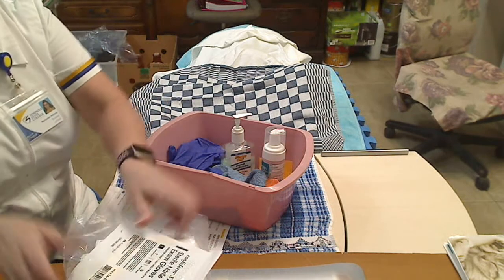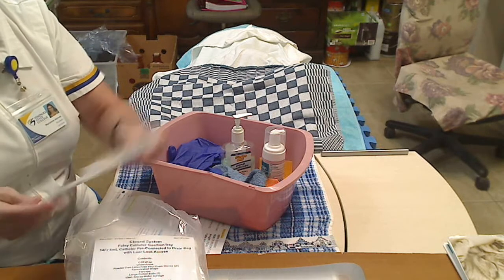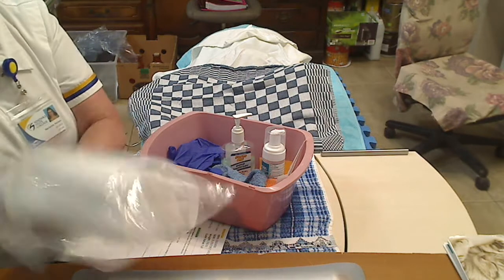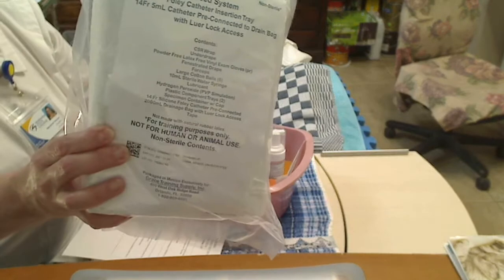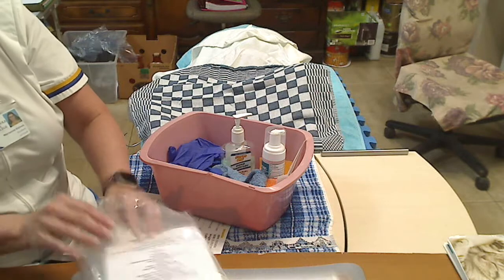Before I do anything, I want to make sure that my packages are intact, dry, and within expiration date. They are. My indwelling catheter comes preloaded with all of the materials that I would need. So I've got that taken care of as well.